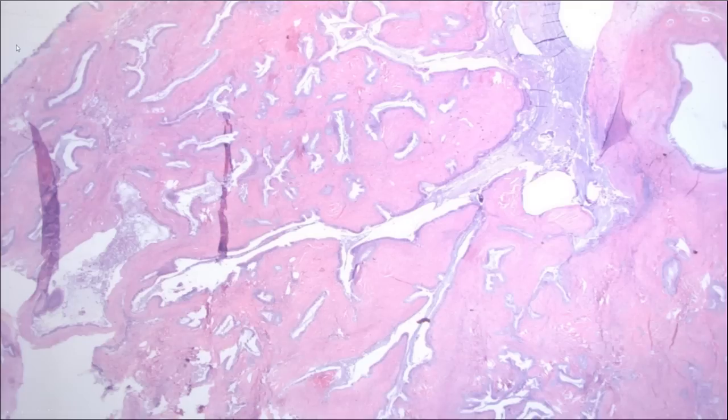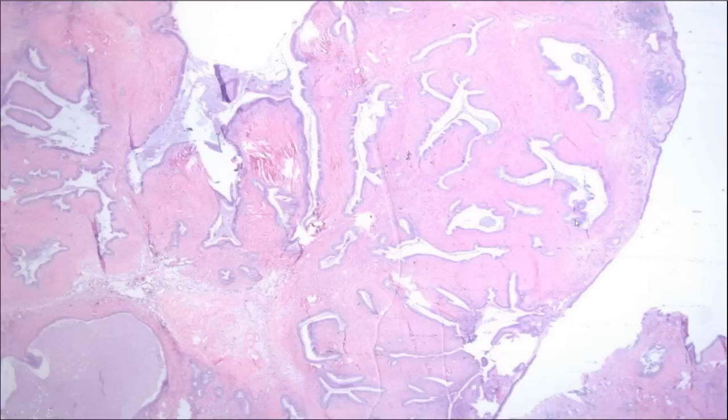You can see this intact mucosa. And one of the things that we began to think about is, is this just some big funny polyp? Is it a respiratory epithelial adenomatoid hamartoma because of these glands? But the stroma just looked weird. It had areas that were hypo- and hypercellular, and some areas, you can even see here, that were a little bit more keloidal. So there was something funny with the stroma as we looked at this polypoid mass.